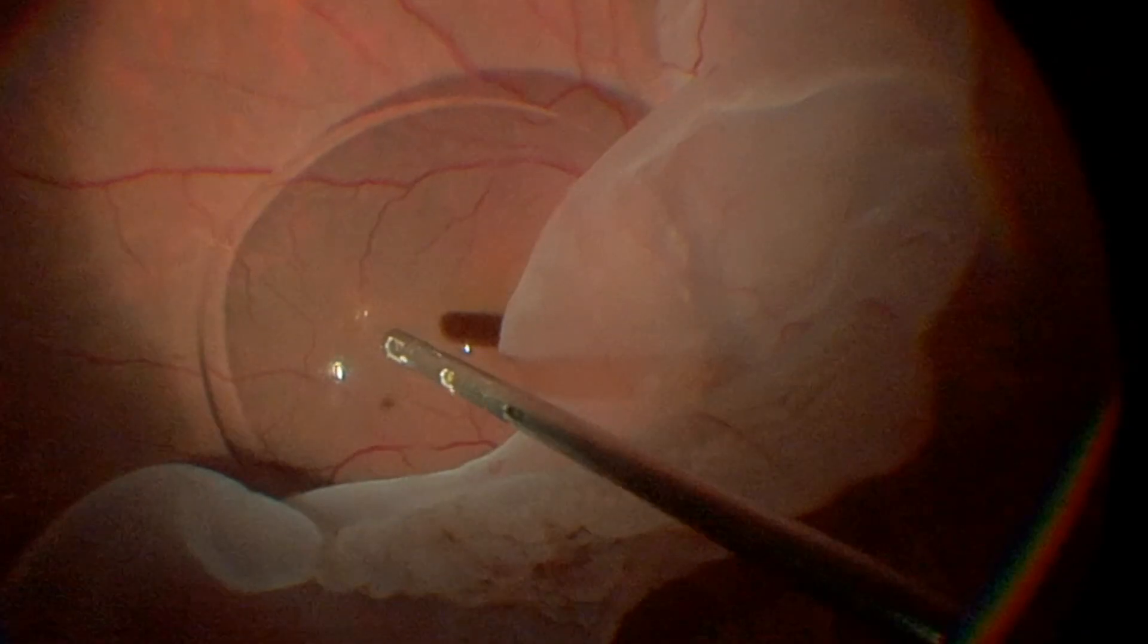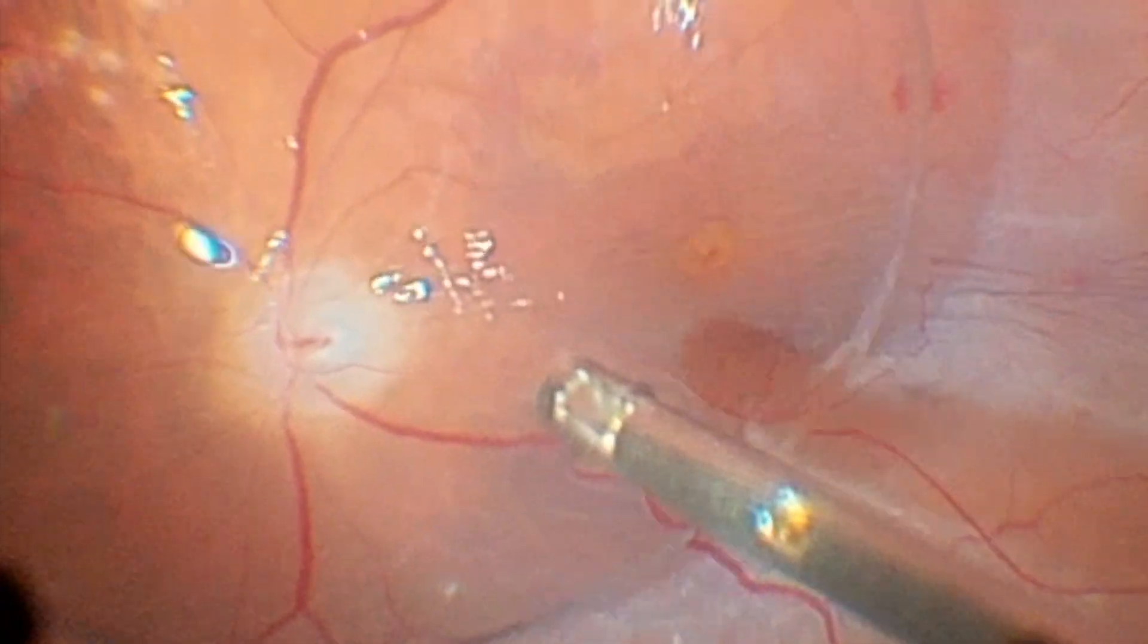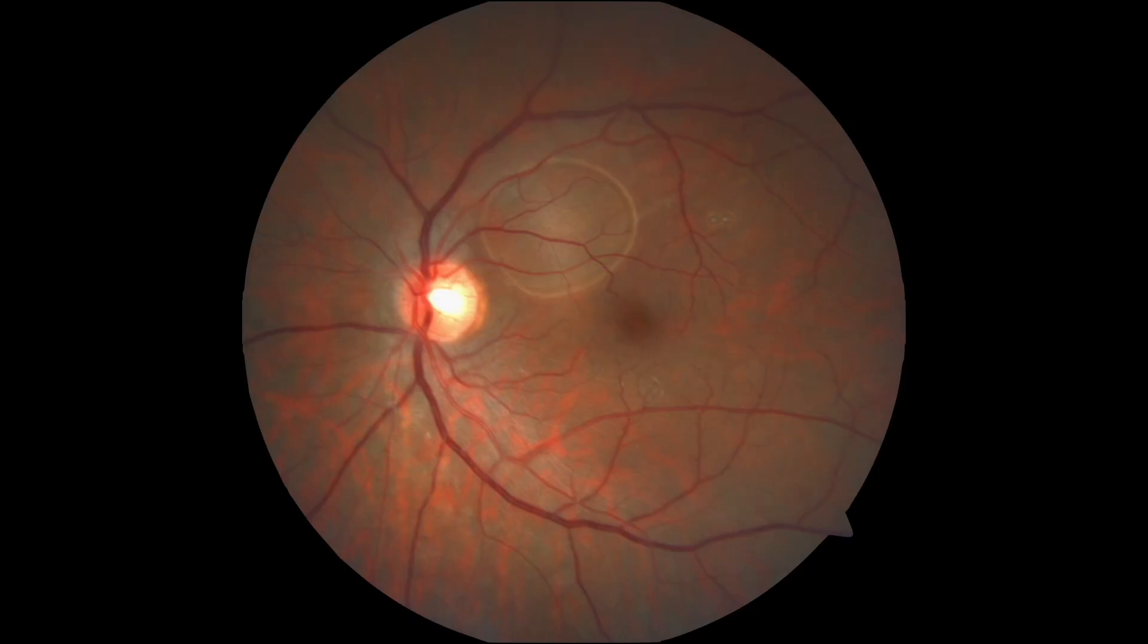It can be useful in managing regmatogenous retinal detachment, giant retinal tears, selected types of tractional retinal detachment, dislocated intraocular lenses, and dropped nucleus. Proper technique during perfluorocarbon injection can prevent complications associated with the migration of bubbles of the substance into the subretinal space.